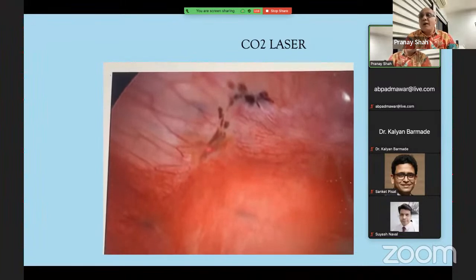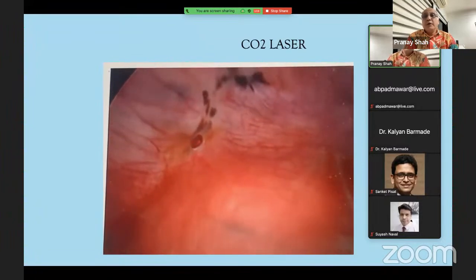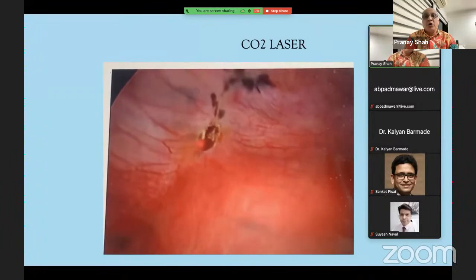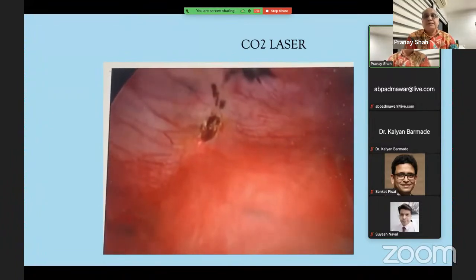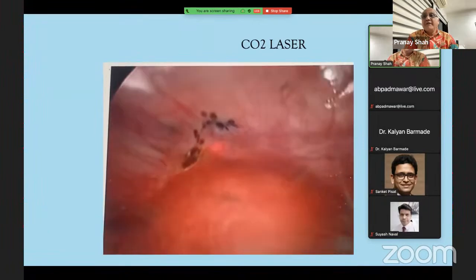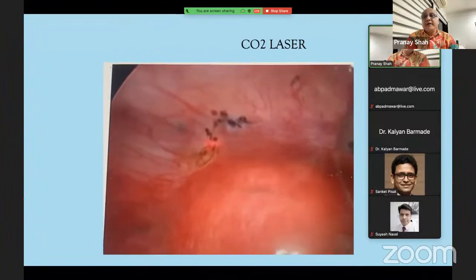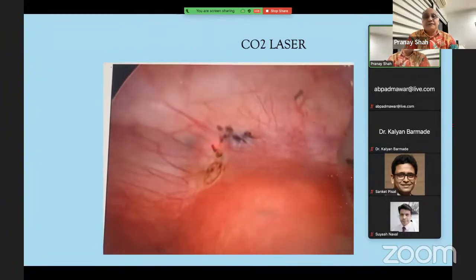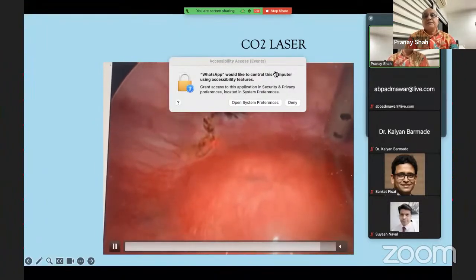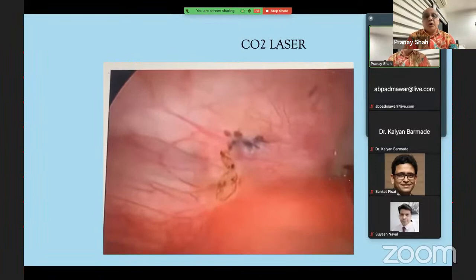A video showing the use of carbon dioxide laser beam to vaporize peritoneal endometrial deposits. Note that the carbon dioxide laser is invisible and the helium neon red beam is used along with the gas beam to make it visible. As carbon dioxide laser is not effective in hemoglobin or chocolate fluid, irrigation with saline is needed to keep the field clean and the laser effective. With carbon dioxide laser, there is very minimal thermal damage to the adjacent tissues or scarring.